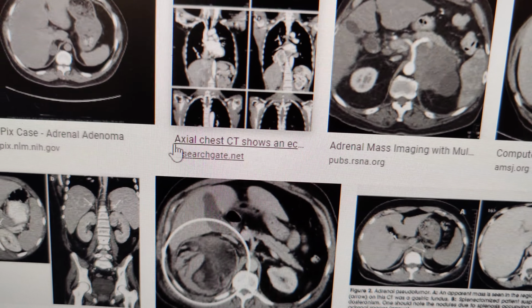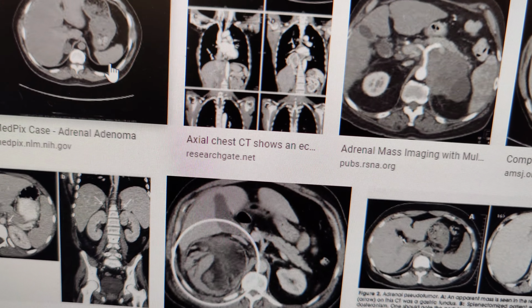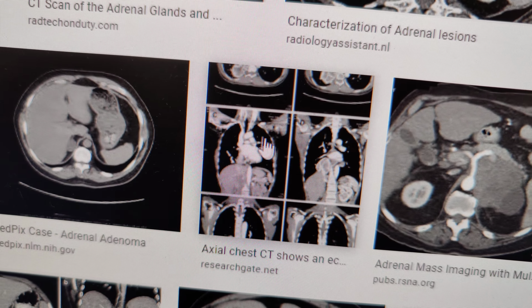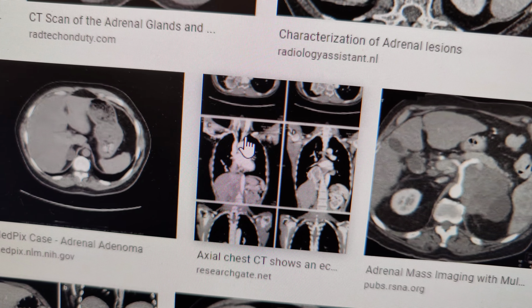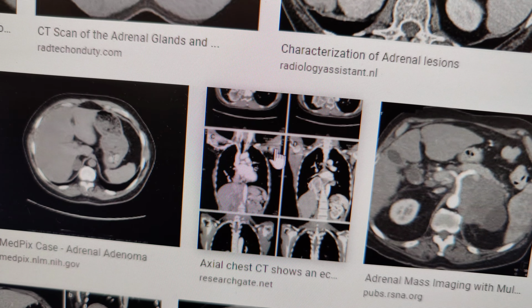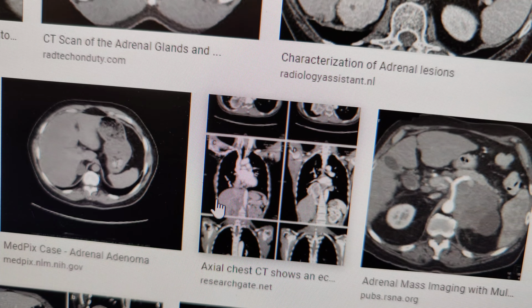so you were correct. When we do scan a chest, this is what we were talking about, the protocol. The protocol here is what we do at this hospital, is we get the top of the apices, so the top of the lungs. So make sure when you start off, you zero at top of the shoulders to make sure you get top of the lungs.